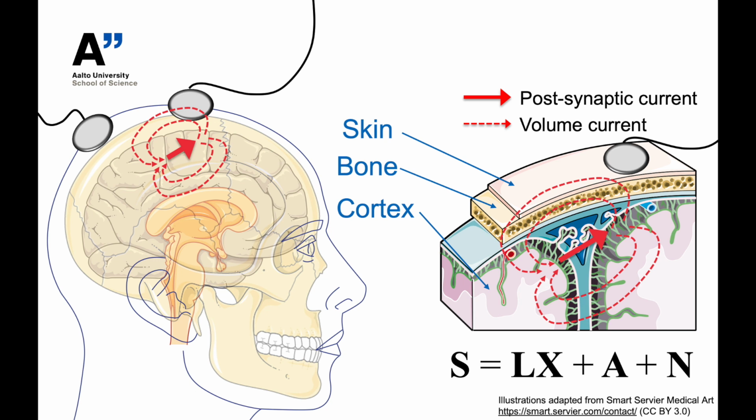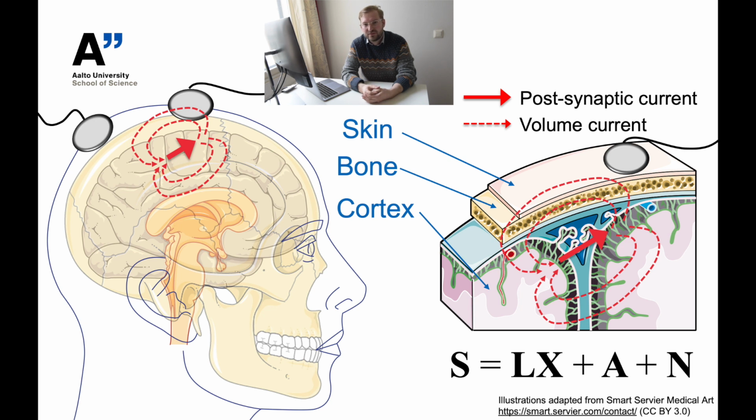So if we can take this prior information and write it in terms of mathematical formalism, we can use it in a powerful way to detect and remove artifacts from our data. This is done in the equation that we can see.